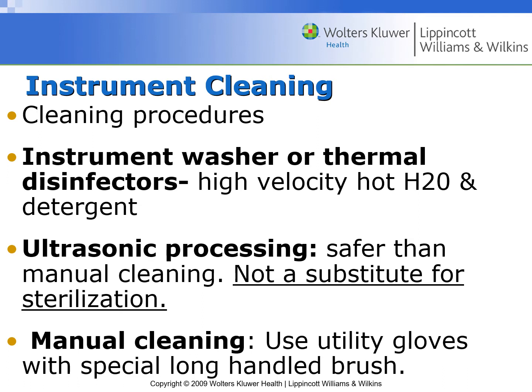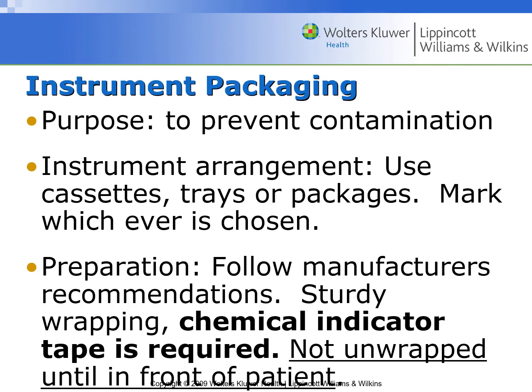If it's not cleaned off when you inspect that case and you still see a little bit of blood on an instrument tip, then you would need to put it deep into a sink, put on some utility gloves, take a long-handled wire brush, and brush over the instruments while they're still in your cassette. What we're trying to avoid is being accidentally stuck. Those instruments are sharp, and they can go right through a glove and into your skin, which is not something you would want. Most of the time, everything can come off by just use of the ultrasonic, so that's a good thing. I already talked about the manual cleaning.